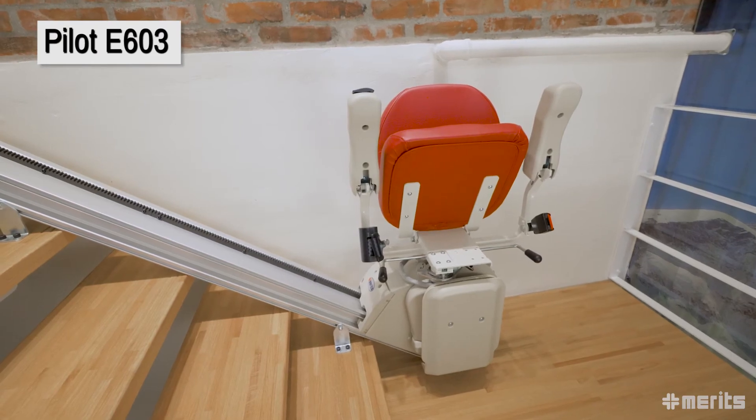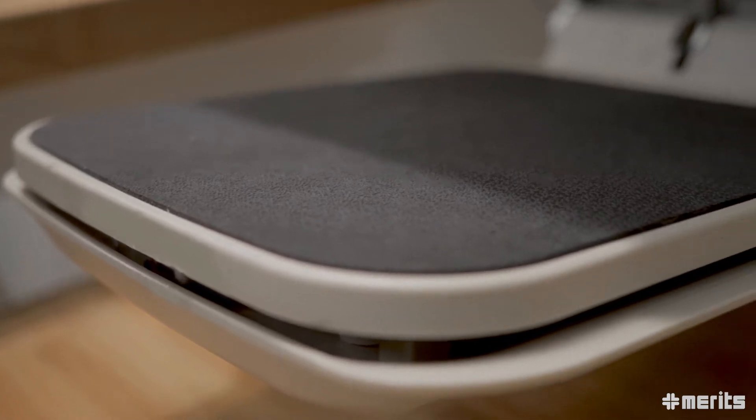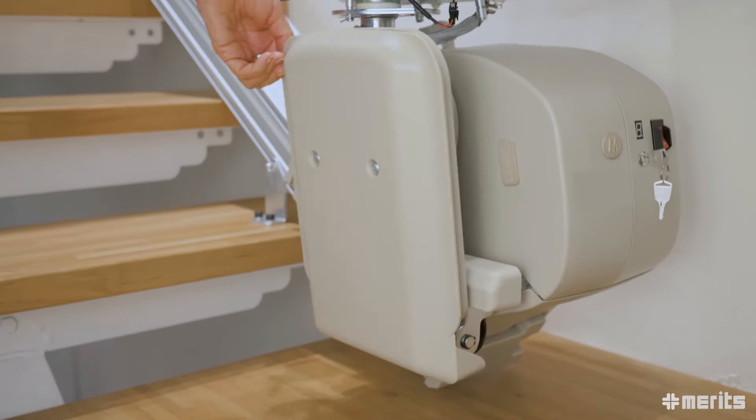The Meritz Pilot E603. This straight track stair lift offers a great combination of comfort, convenience and safety. When not in use, the Pilot E603 has a very small footprint.